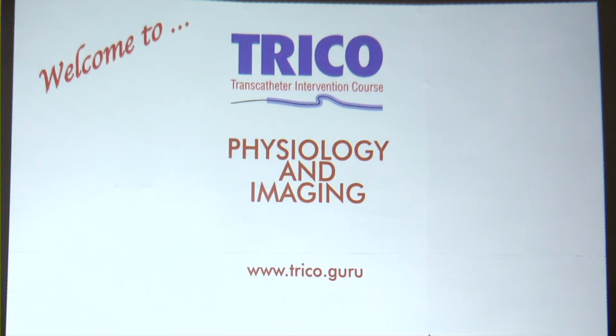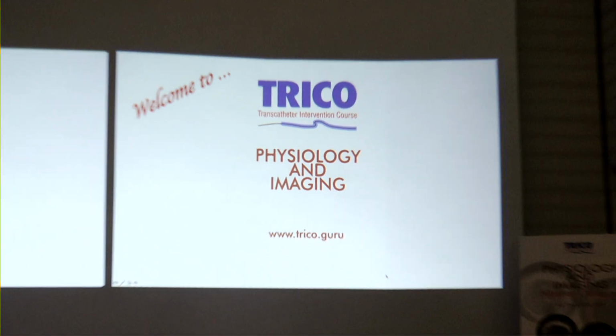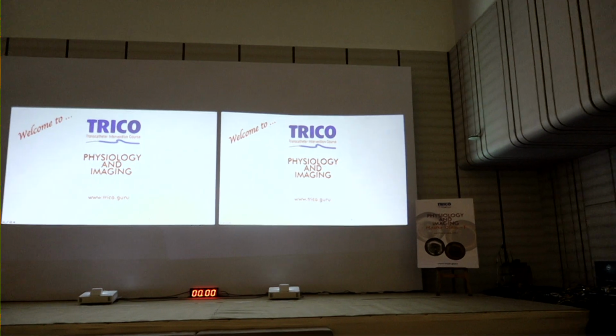Thank you, Dr. Akasaka. I think it is still a subject where we don't have the real treatment available, and we are just trying to improve the lumen in this area. But yeah, it was a wonderful presentation. Thank you.